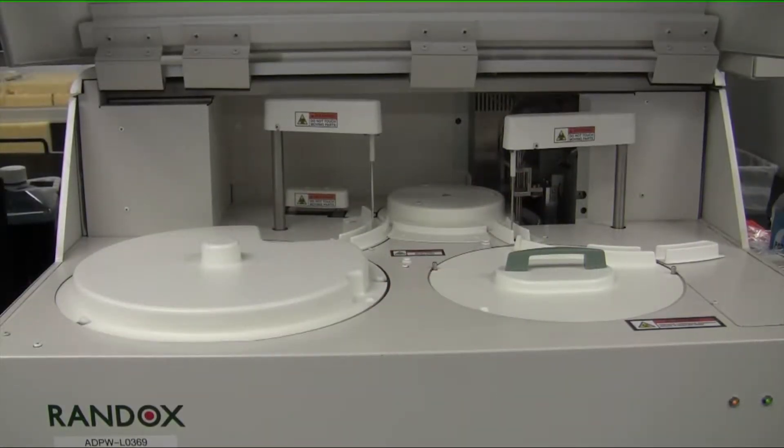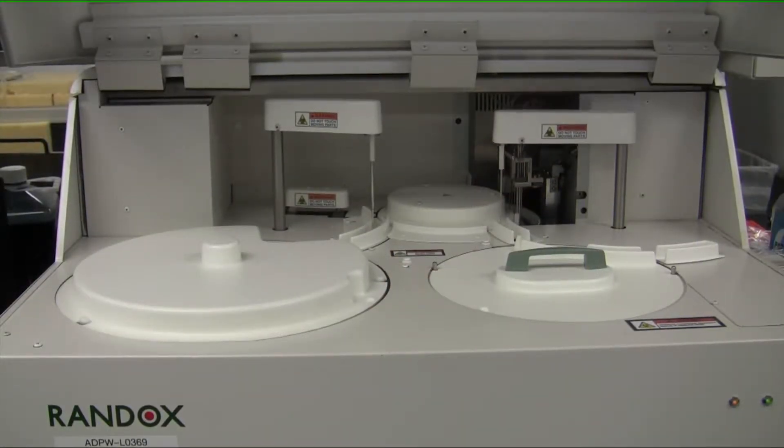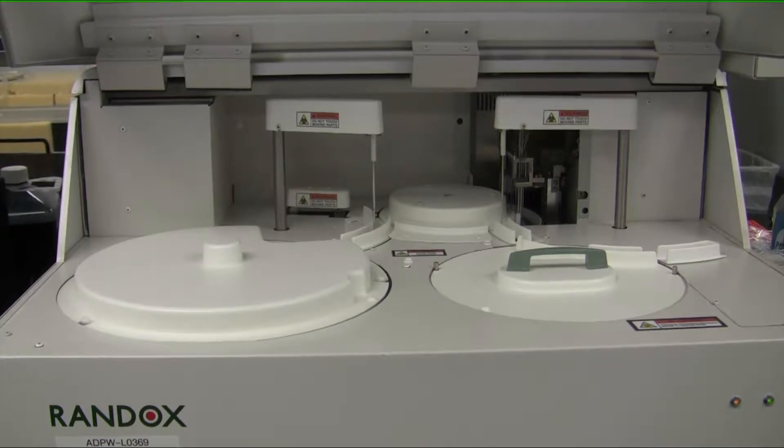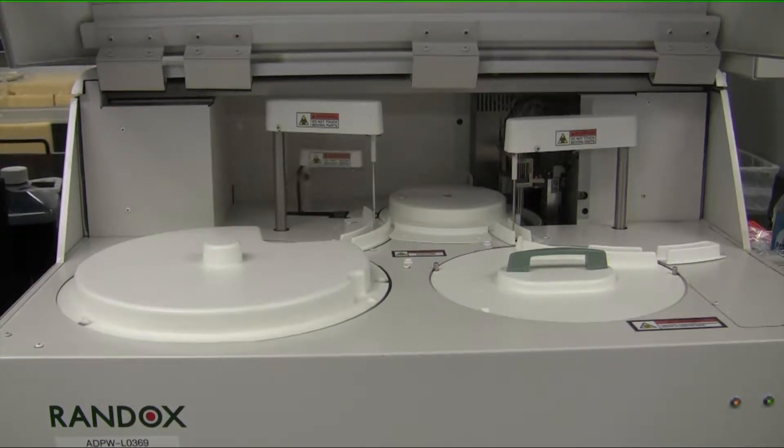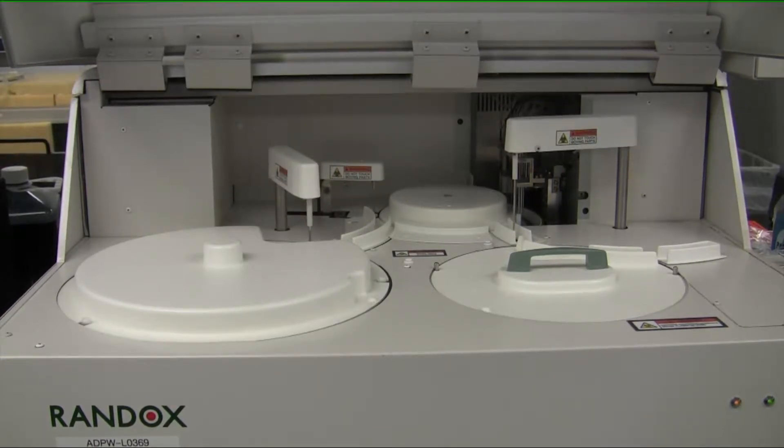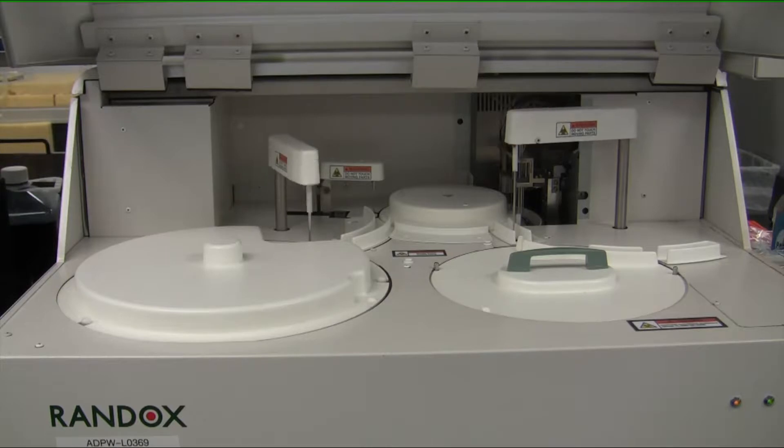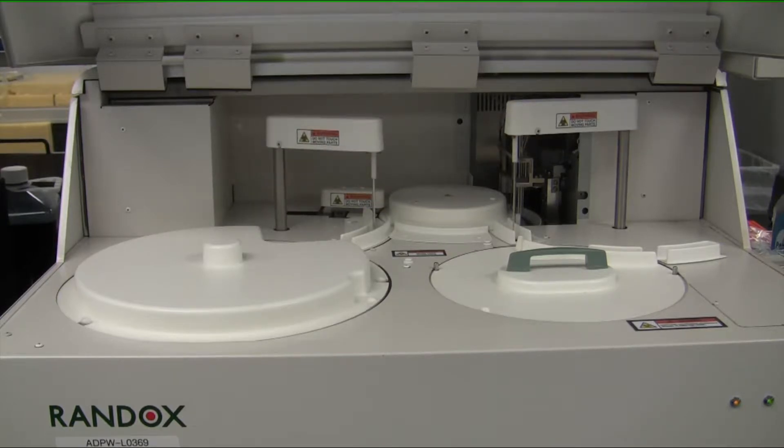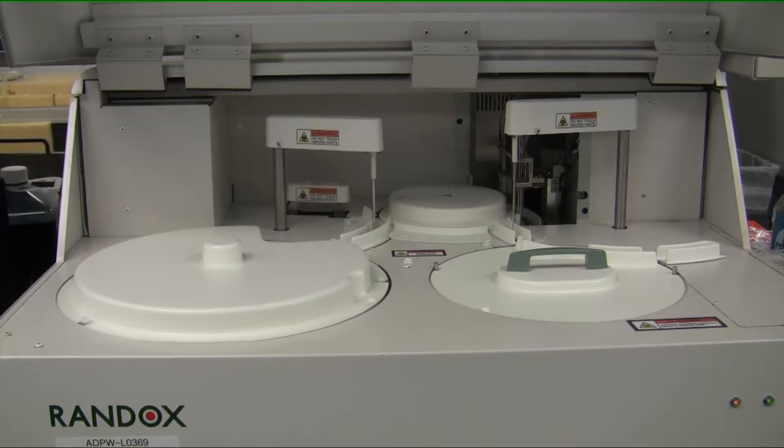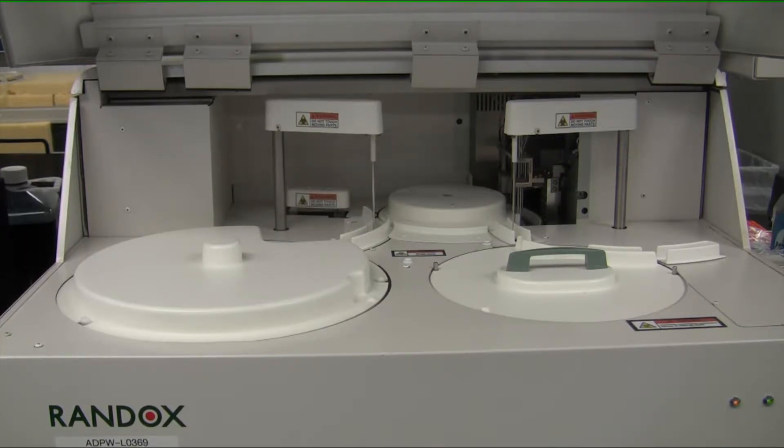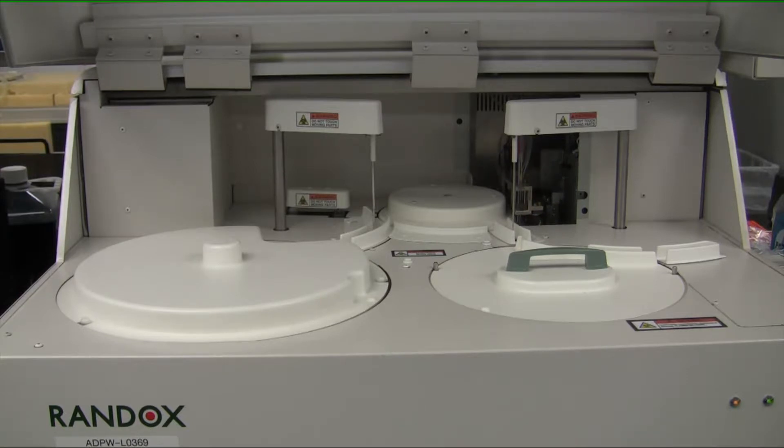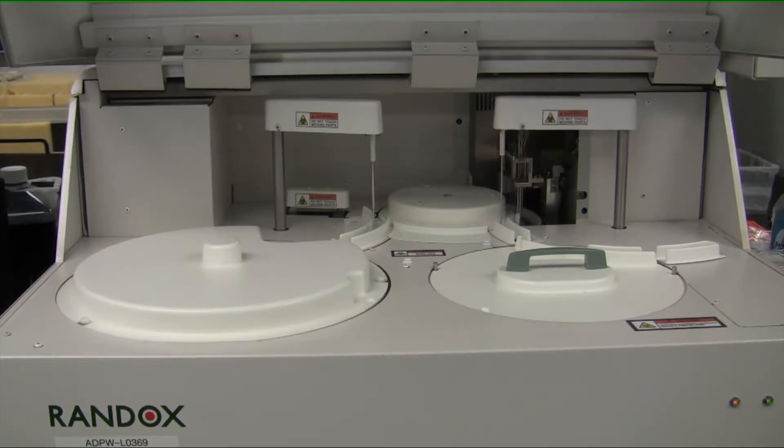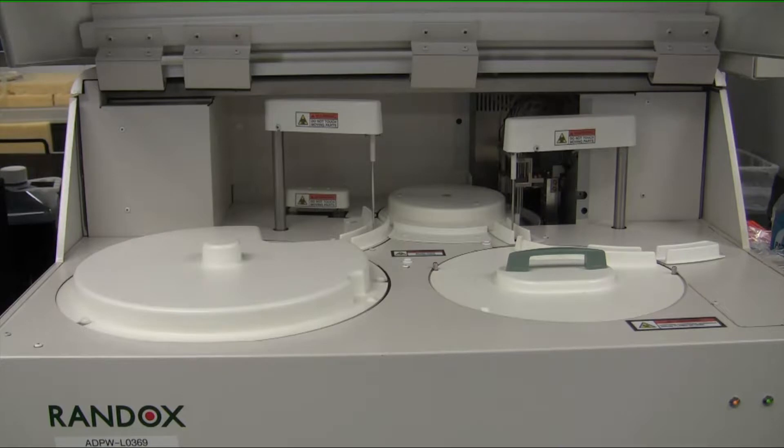So this is the instrument in operation mode. On the right hand side moving, you see the sample pipetting arm. On the left hand side, you see the reagent pipetting arm moving. Those two arms work together. The right arm pipetting sample into a cuvette. The left arm pipetting reagent into a cuvette. In the rear, there is a mixing paddle, which mixes the cuvette.